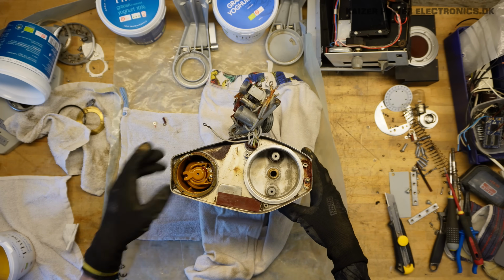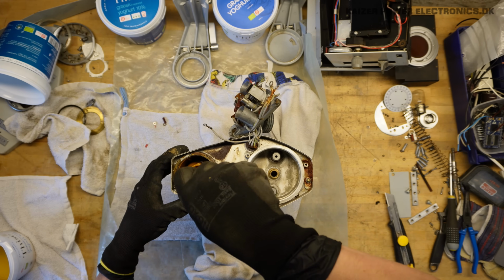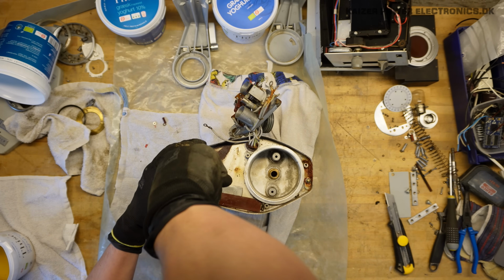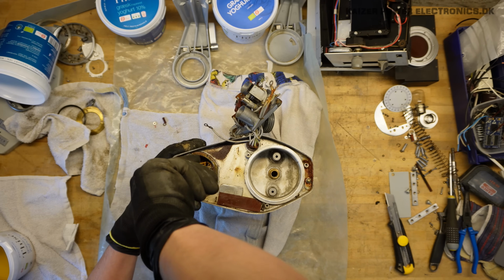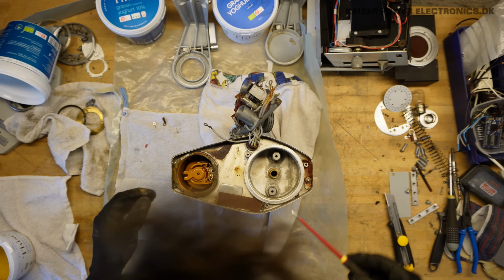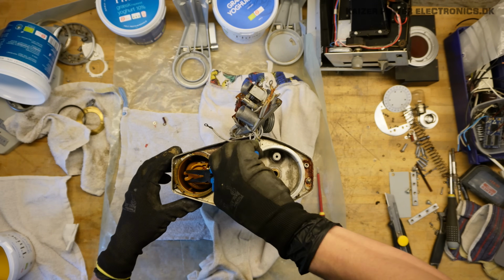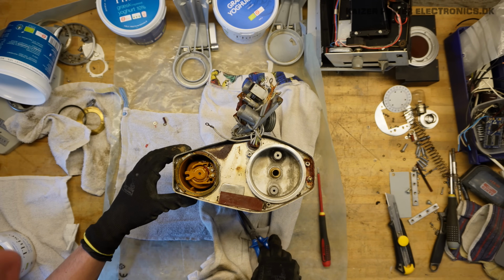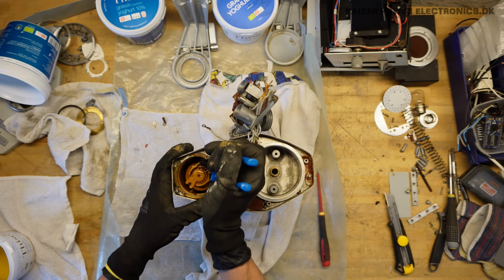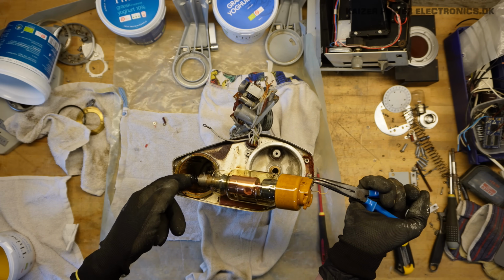So there seems to be like 2 screws with golden spring wire sitting down here. And I would guess that once these are released, we can actually bring out the X-ray tube. Ah, okay, that's just spring-loaded. We actually didn't need to remove that. So let's just try to pull it out. It's most likely sitting in a socket of some kind. Yeah, okay. There it goes. Wow, look at that beauty.